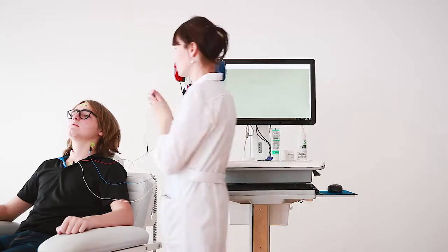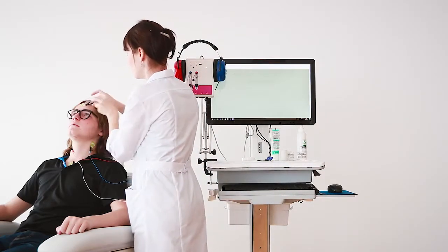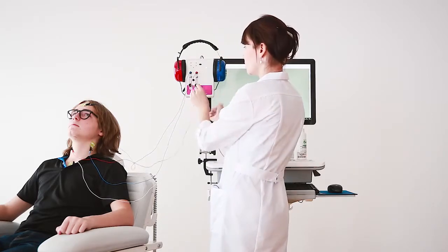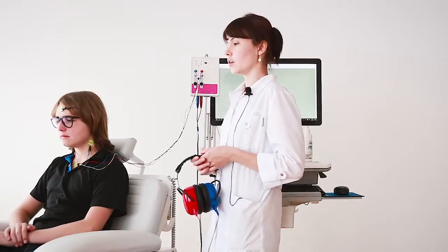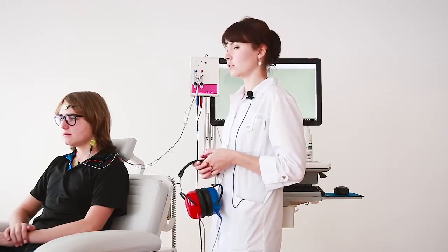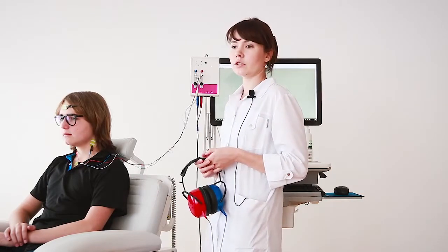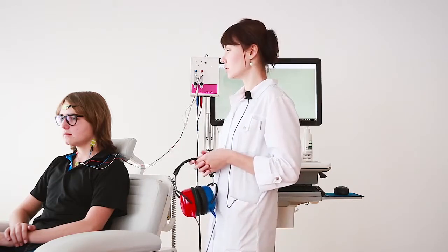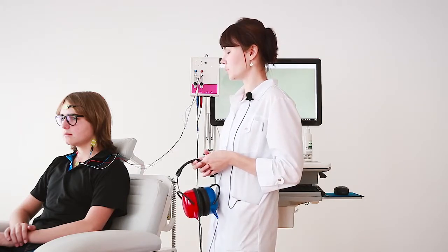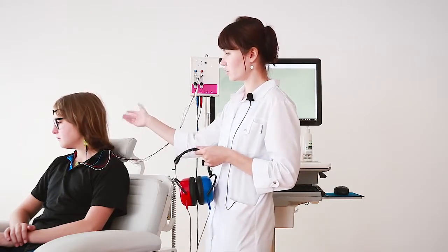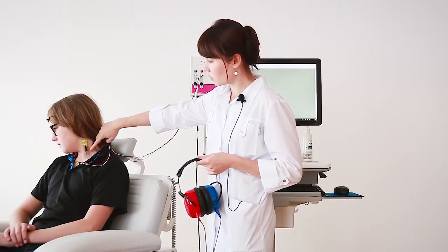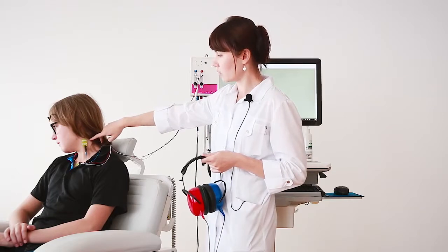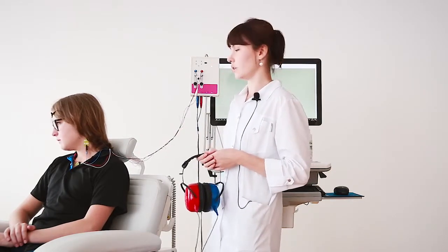The ground electrode we connect to the common channel. Before starting stimulation, we need to instruct our patient how to contract the target muscles. To contract the left sternocleidomastoid muscle, I ask you to turn your head to the right and look down a little. We can see the muscle well, and the same way to the other side.